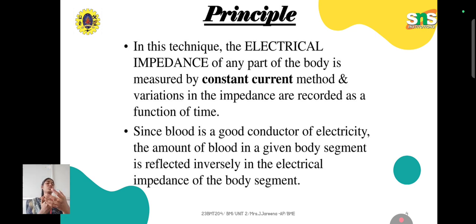So in this principle, the change in resistance is the part we are going to assess. For that we send some constant current, and whenever the constant current strikes the resistance, you can see some potential drop, which in turn says what your change in resistance is.